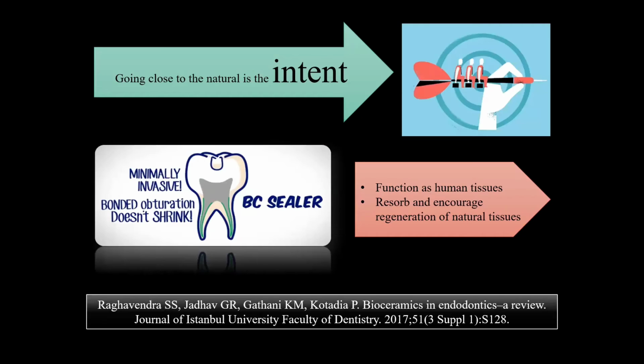Now, historically, a single cone technique was used with zinc oxide sealer or resin cement in a canal of variable taper preparation that resulted in a lot of space around the cone due to the shrinkage and the resorption of sealer over time. As a result of these two specific limitations of zinc oxide eugenol cements, the term single cone technique was associated with low quality obturation. This led to the search for newer techniques to compensate for these shortcomings.